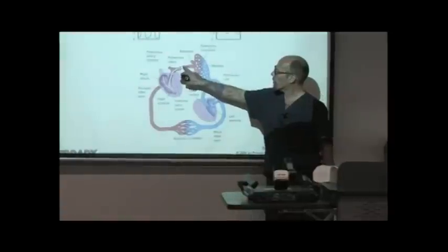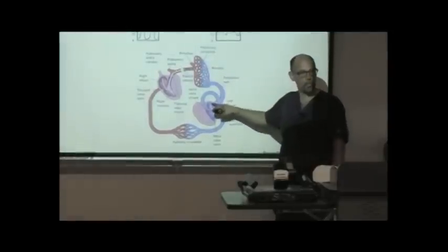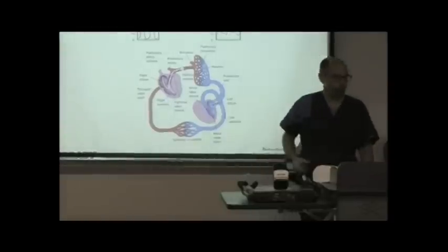So this slide is showing you what we used to do, how we would use this. If I inflate the balloon and I'm transducing that distal tip, I'm looking forward through all of the pulmonary circulation all the way over to the pressures inside of the left atrium. Now we use the pulmonary artery diastolic pressure. What you will find is in most patients, the pulmonary artery diastolic pressure is the same as the wedge pressure that I would read. So rather than inflating the balloon, I'm just going to look at the PAD and go, yep, that's the filling pressure on the left side of the heart. Closely approximates that. Much safer than inflating that balloon.